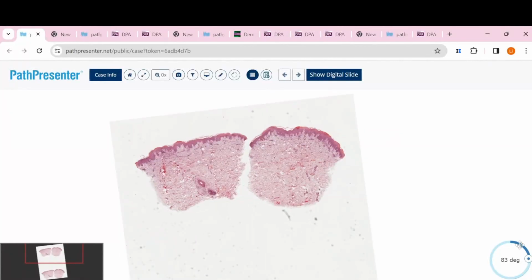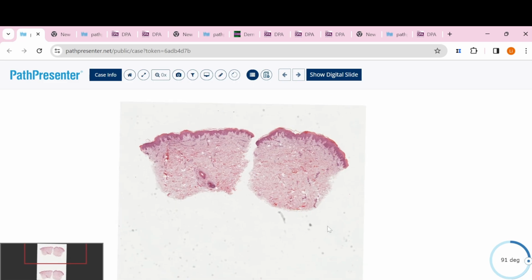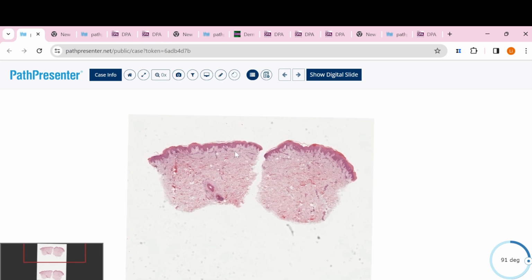The diagnosis is pityriasis rosea. This one is really tough to make the final diagnosis like this, honestly. So I don't know how the test will test you on this diagnosis. This one also falls into the spongiotic dermatitis chapter because when you see low power like this, you're just thinking just like normal skin because you do not see any dramatic changes here.